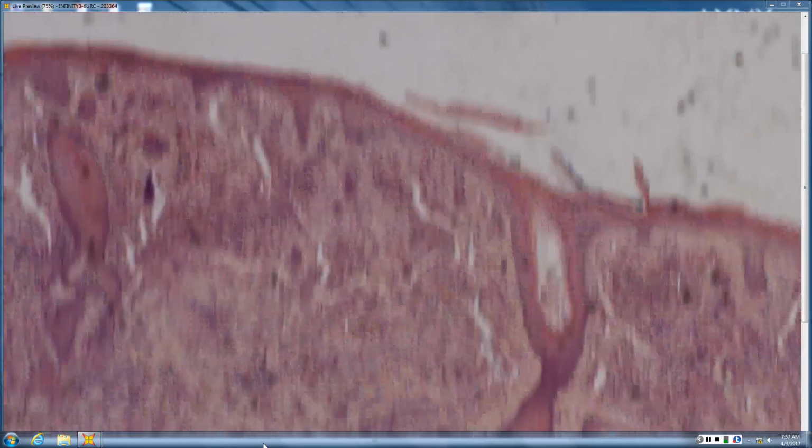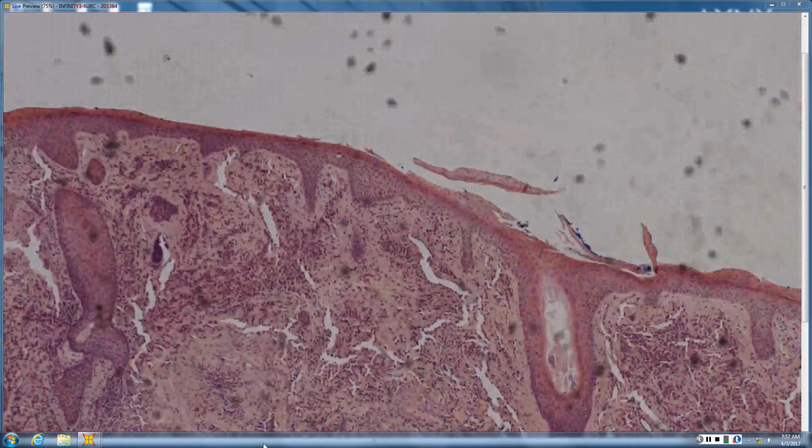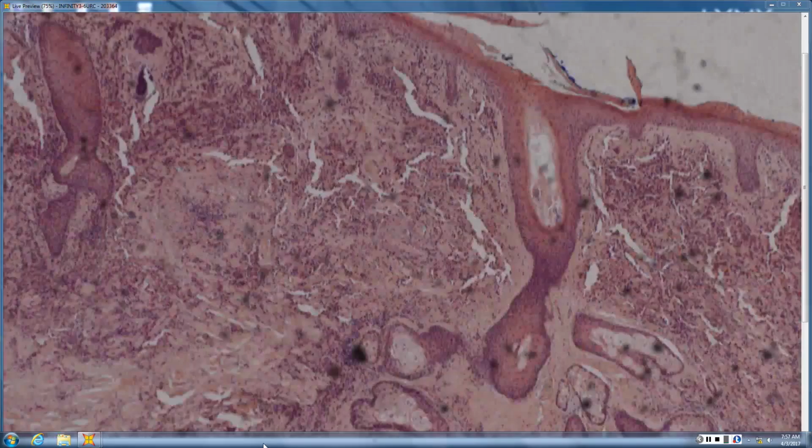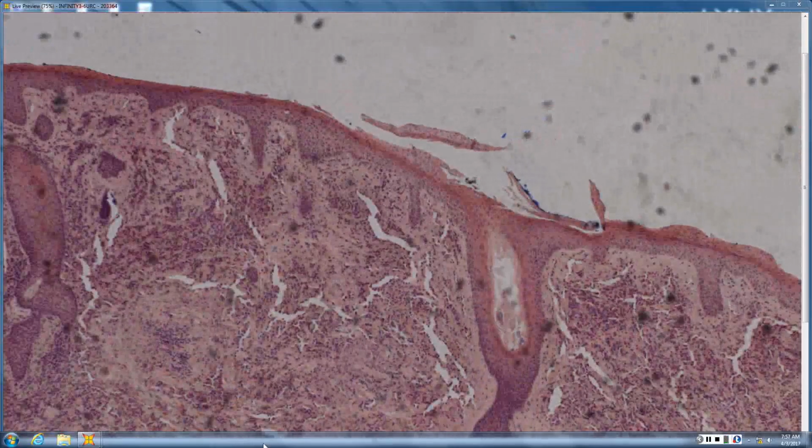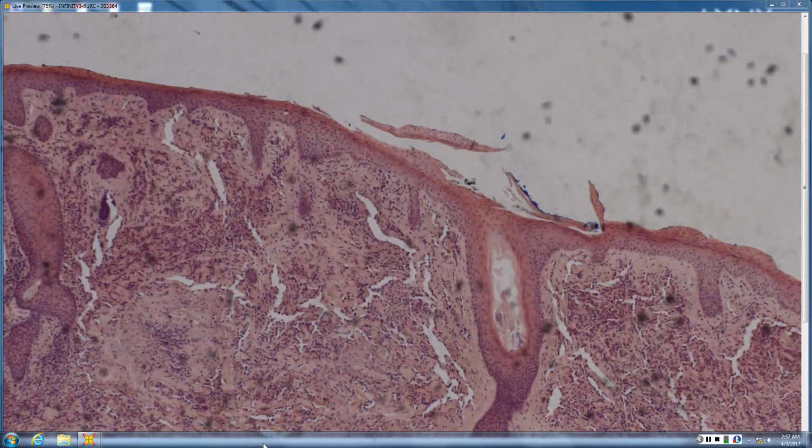Let's pick up the pace here. What do you see? Busy dermis, crack-like spaces. What are you thinking? Something bad, like an angiosarcoma, and you see the big hyperchromatic, ugly hobnail endothelium sticking into those crack-like, as opposed to crap-like, spaces.